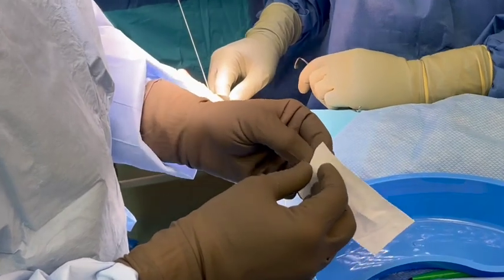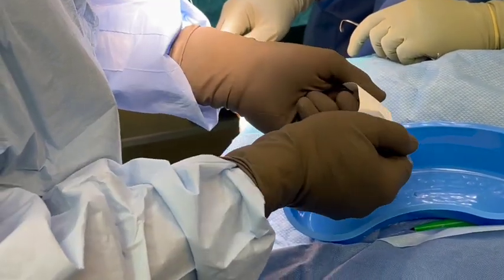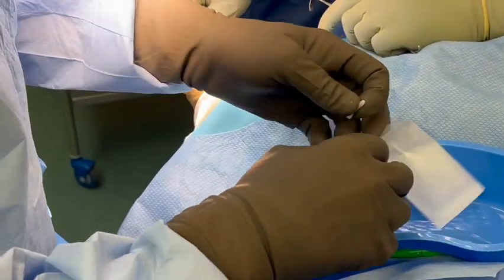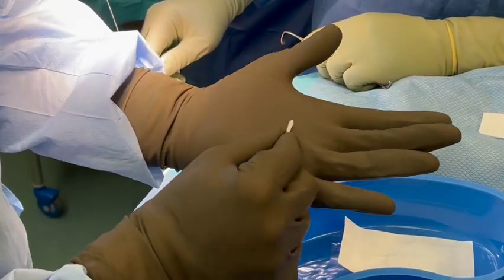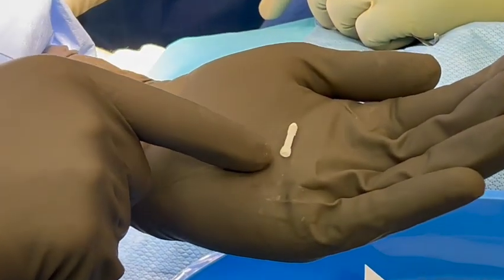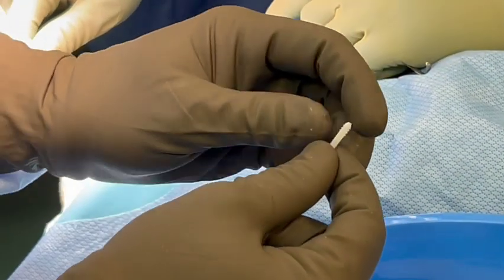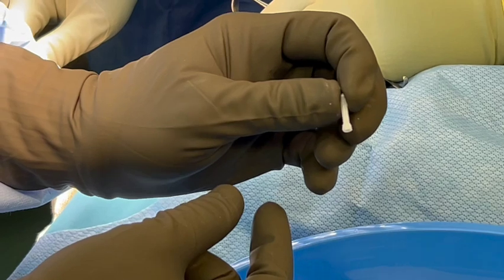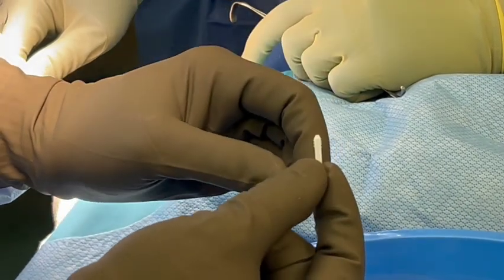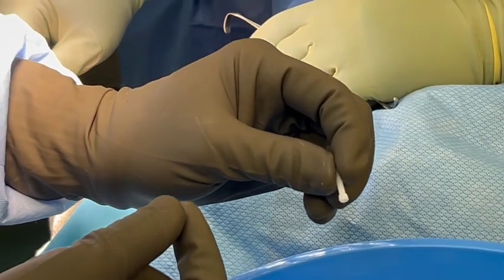Here we have the implant — comes pre-measured. You can come take a look at this closer. You can see that there are threads here, and once the head engages, it'll pull the site together. But this is what the actual screw looks like. It's made of natural bone product, very strong, and will dissolve like the pins do over time and incorporate into the bone.